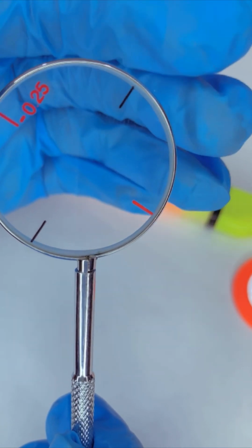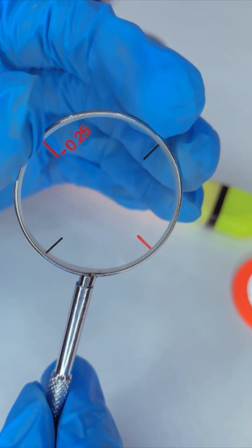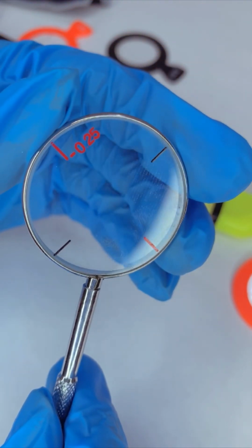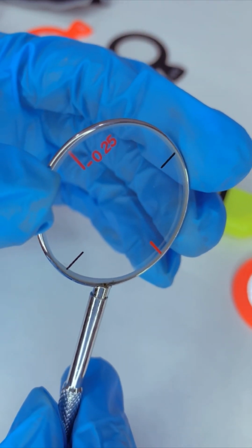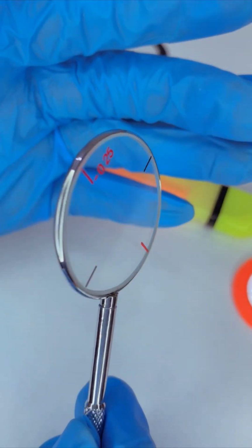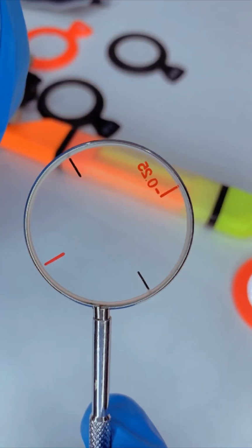So in this very session, I want us to look at the technique, how JCC is used to refine the axis of a cylinder, or the power of a cylinder, or to refine either the axis or power of the cylinder, as it should be. It's a very simple technique, and I think that at the end of the video, we are really going to appreciate the concept as it should be.